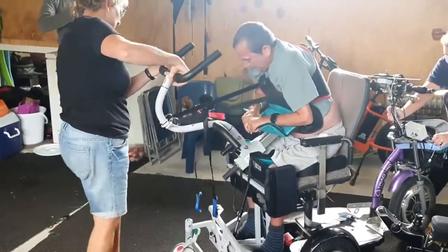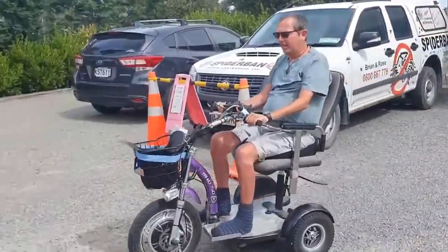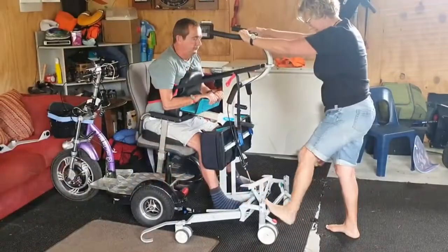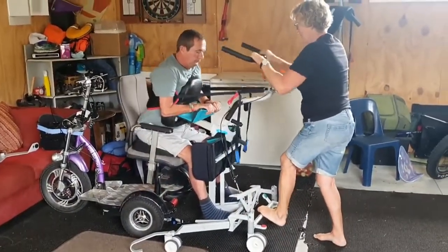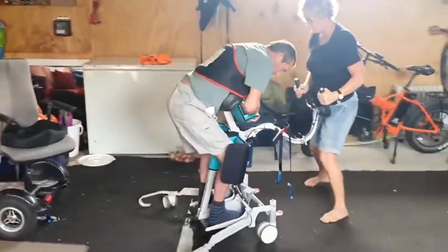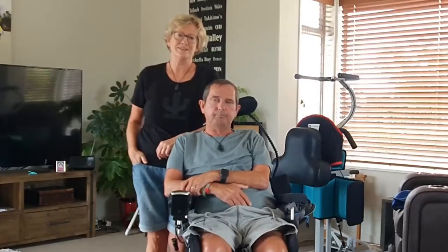For me, the thought of using that sling hoist — there's a lot of faffing around with them, a lot of turning and putting it under and fiddling around. But with the Carer, you can just go in and up and it just takes a few seconds. It's really easy.